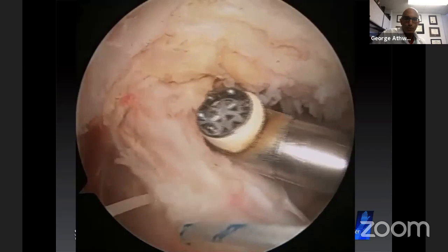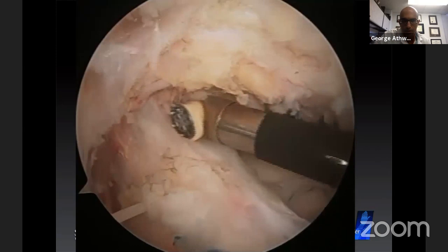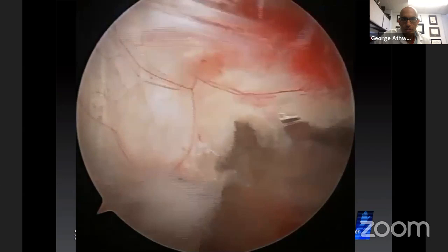staticky. So this is the coracohumeral ligament. I'm releasing just a little bit of it, just so I can see the upper edge of the subscap, right there. You can see the nice rolled upper edge of subscap, so I can place my top suture in the best position to really reduce that subscap. So there's the anatomy, CA ligament, coracoid, conjoint tendon. That's the conjoint tendon. And here's my medial row.